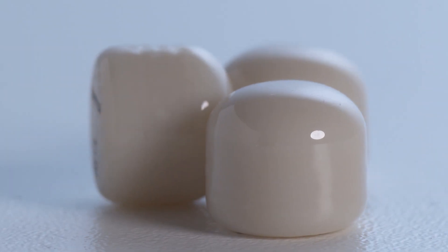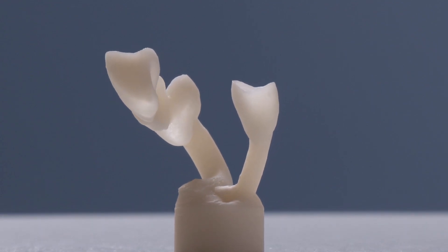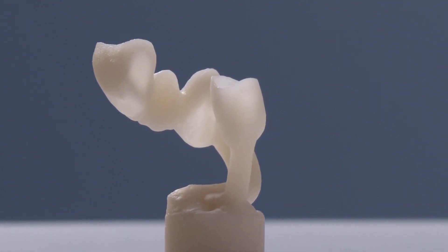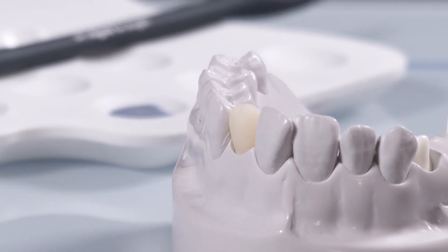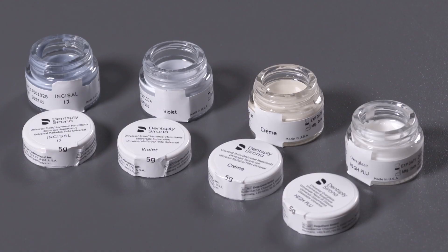Due to the exceptional light optical properties of Seltra Press, you can achieve excellent aesthetic quality already in a monolithic restoration. Customization with only three universal stains and the final glaze can be carried out quickly and accurately.